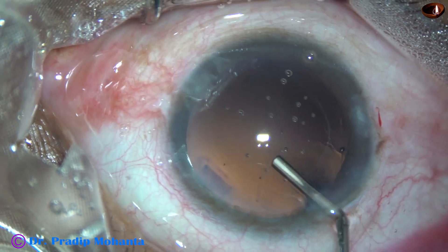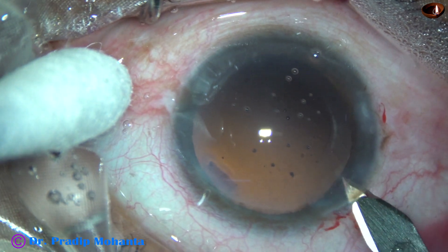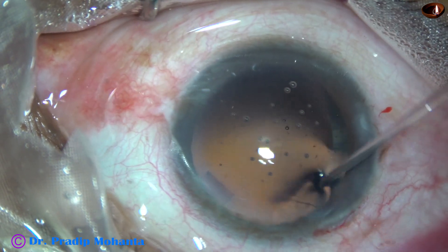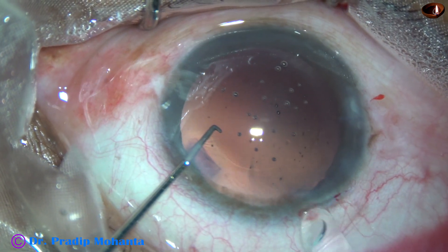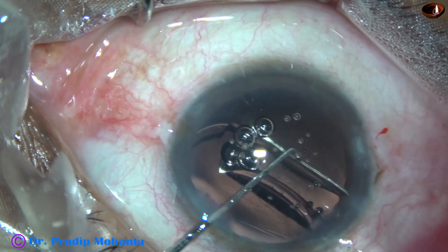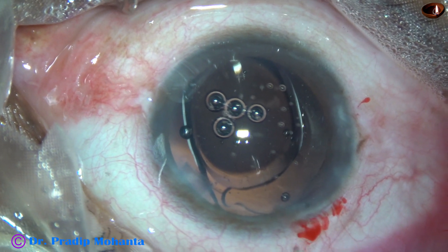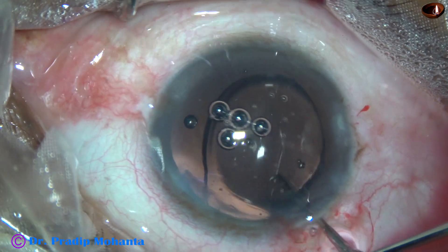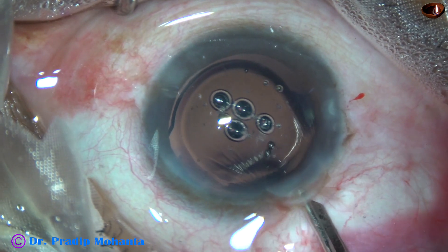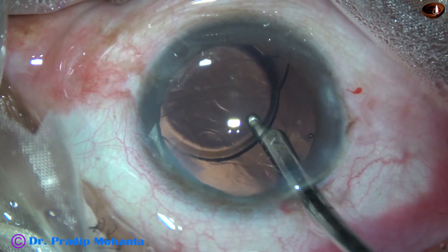Now the capsular bag and the anterior chamber is filled up with visco, and then the main wound is enlarged a little bit. When you have a wound just behind the limbus, you can enlarge the main wound — this will help in implantation of the intraocular lens. This is a hydrophobic acrylic single-piece monofocal intraocular lens, and it has been placed in the capsular bag. If you can't implant the lens with a stroke of the left-hand instrument, you can go through the right side port, use a Sinskey hook, and place the trailing haptic in the capsular bag.